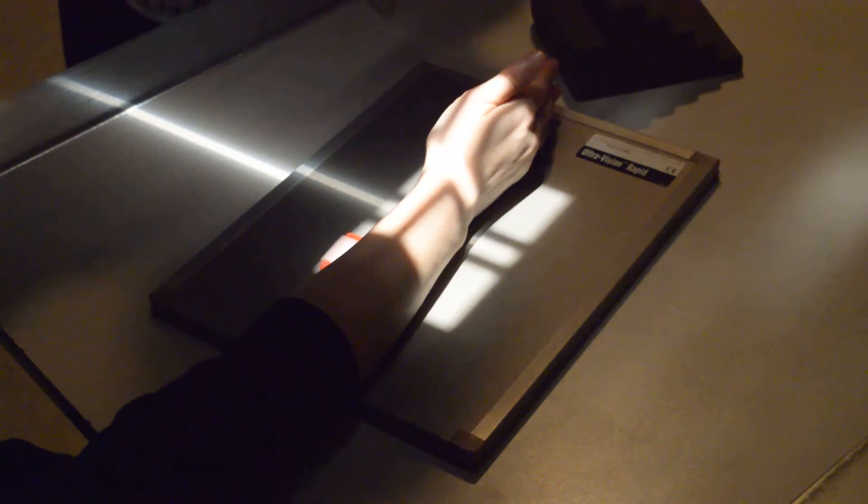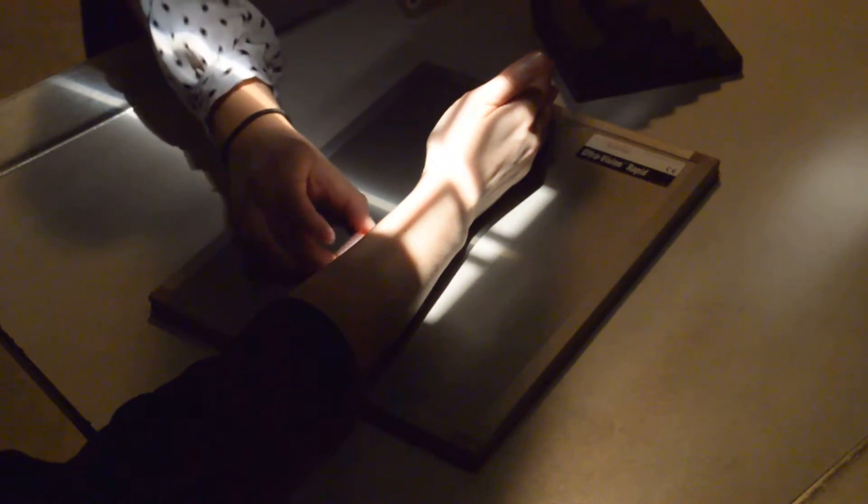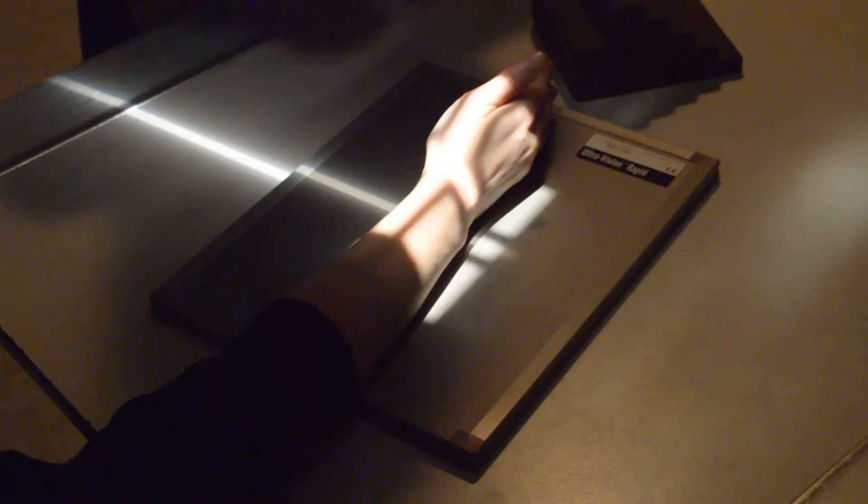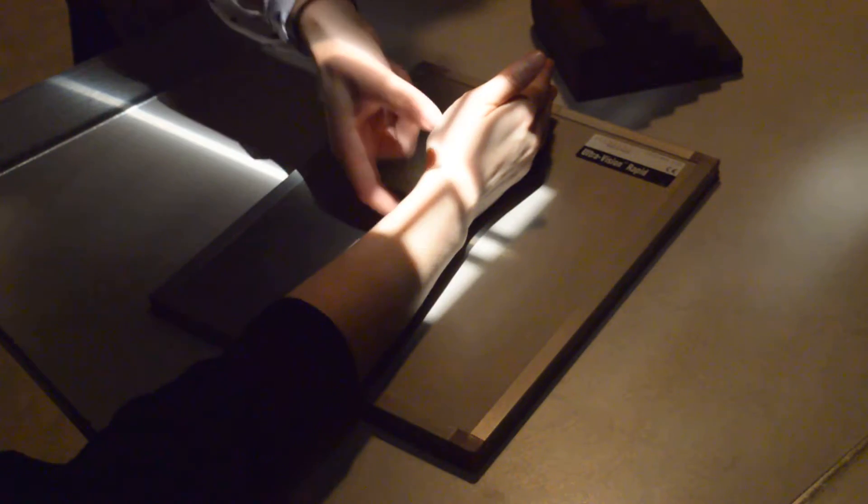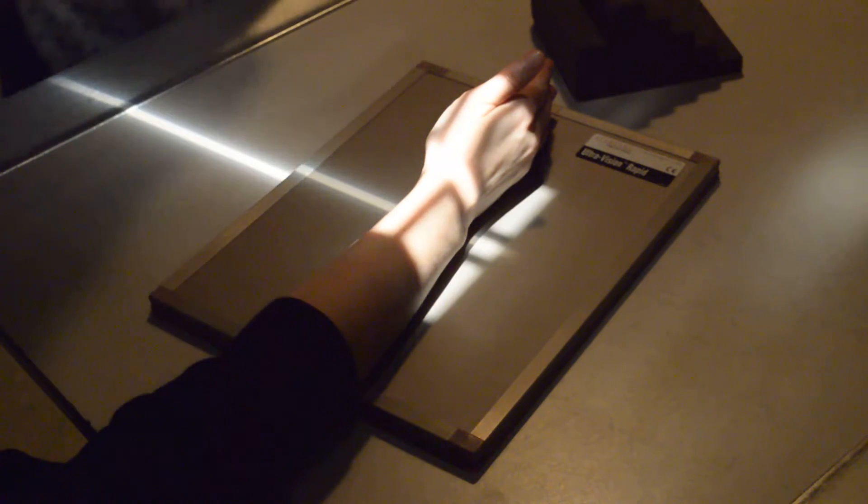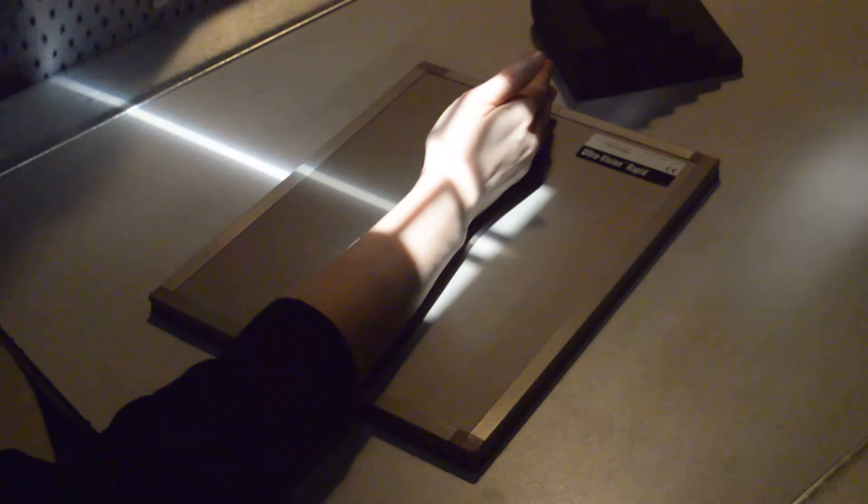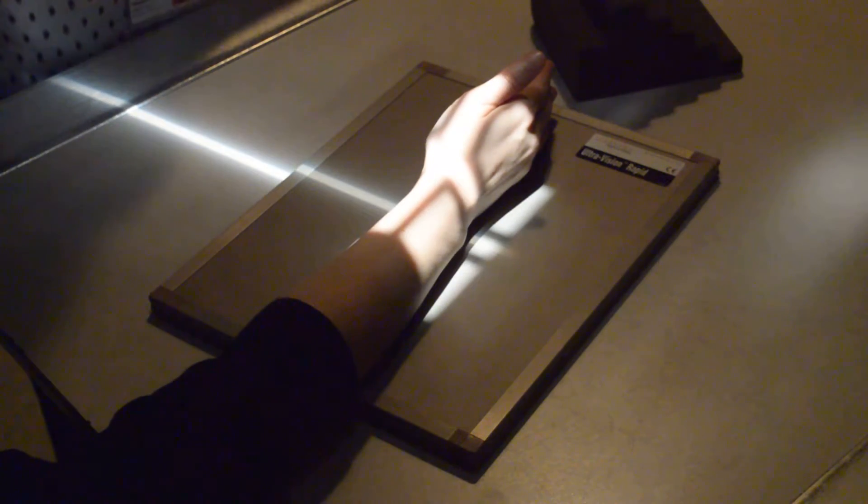Centered right over the wrist joint. I can collimate side to side a little bit more. Include your marker. You're going to measure right through your central ray. Give your patient good positioning. Ask them to hold still and click.